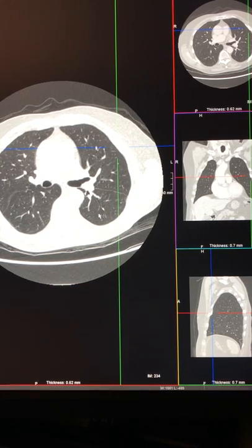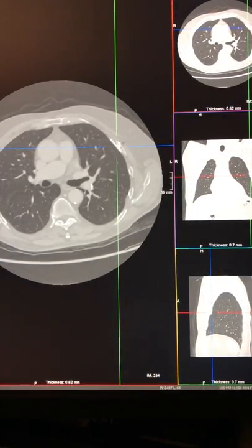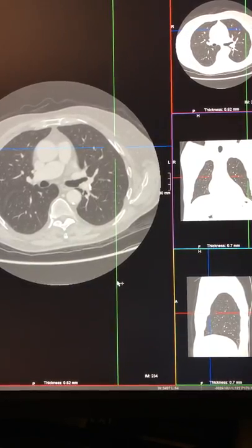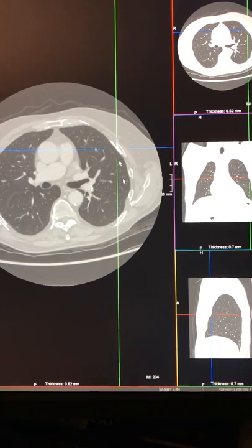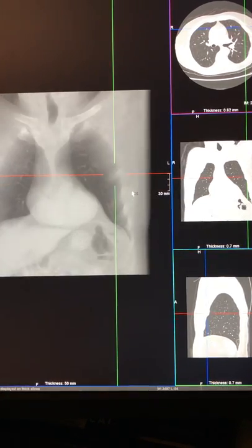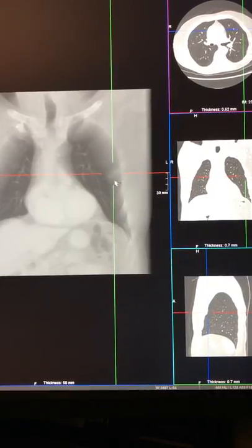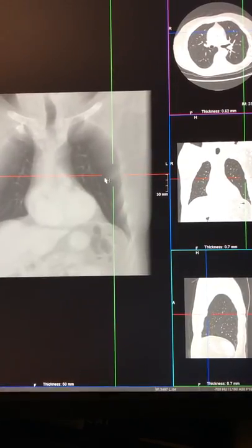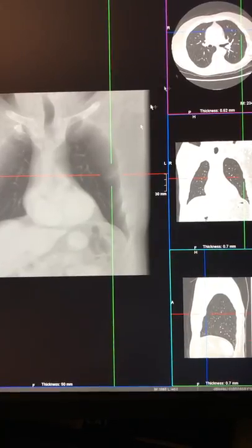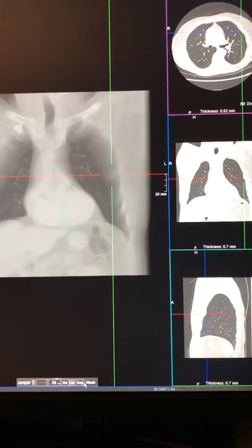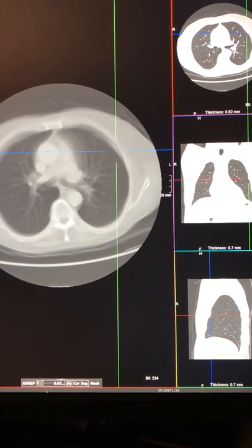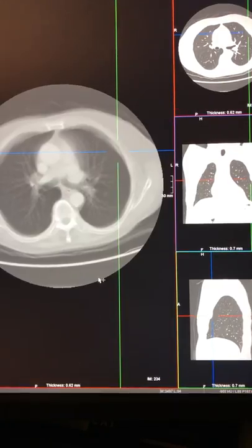Due to the fact that there is a lot of air-containing alveoli behind, there is a reasonable amount of radiation penetrance, and therefore when viewed from the front it is often seen as a subtle, ill-defined area of opacification. But given that the margins of the calcifications are sharp, it does have a reasonably contained boundary, giving that geographic type appearance.